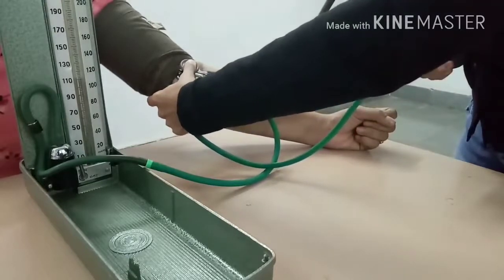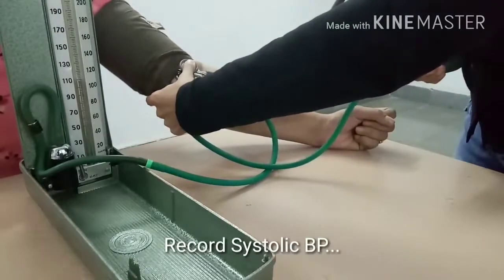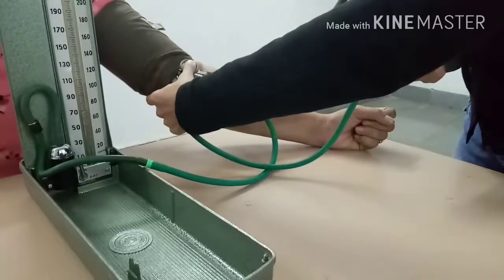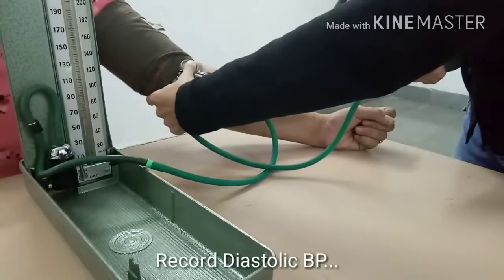And the point at which sound muffles or disappears is the measure of diastolic blood pressure.